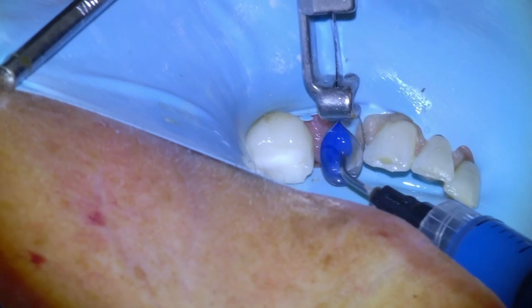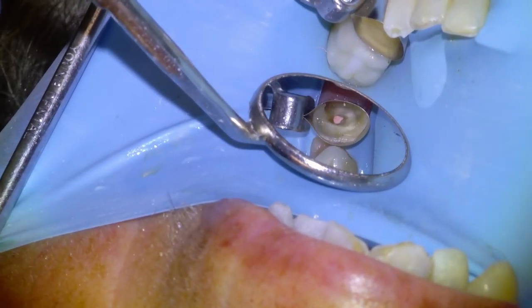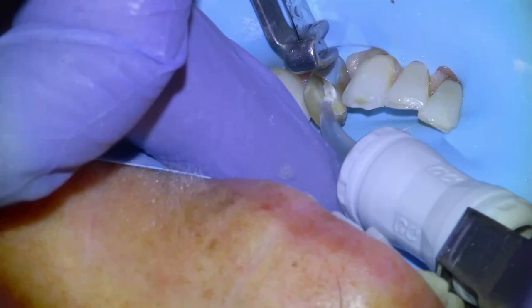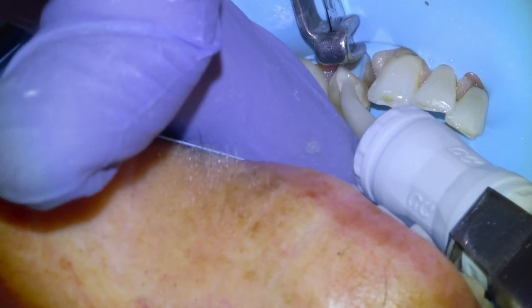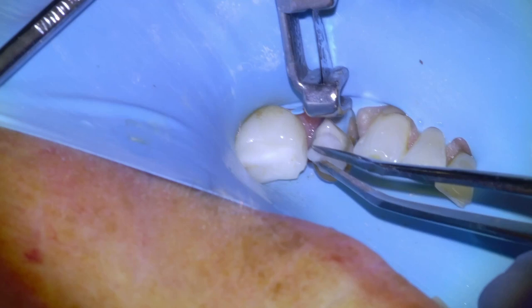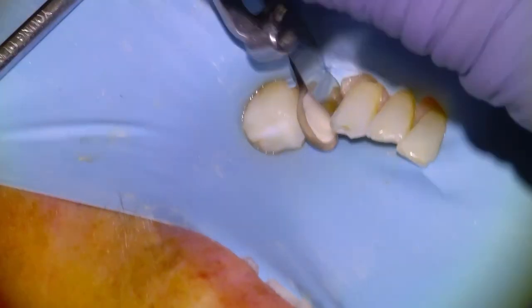Anytime I'm bonding a glass restoration I'll etch for five seconds, rinse thoroughly, dry, add our Equia Forte, tamp it down with a cotton pellet to ensure adaptation, and then I'll usually wait four minutes to set.